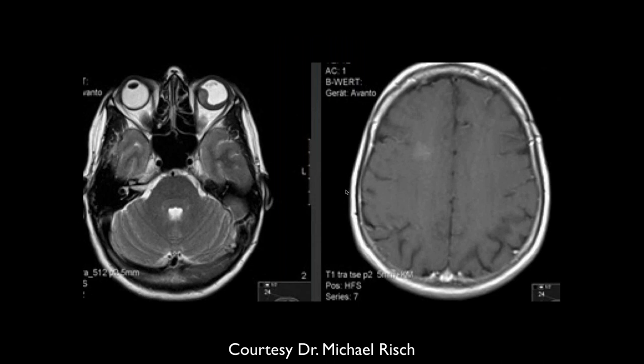Okay. So similarly, in this case, it looks like there's a mass in the globe on the left, and it looks like a little enhancing, ill-defined area in the right frontal lobe. Could possibly be choroidal melanoma with mets.